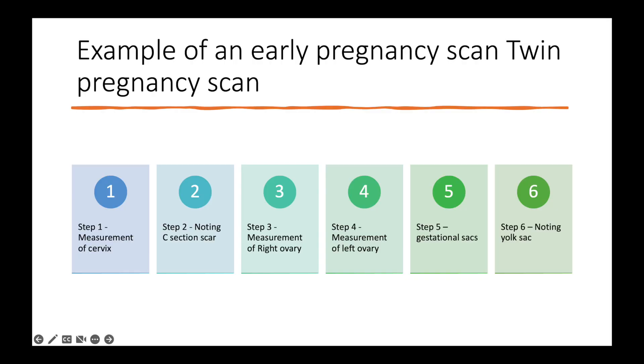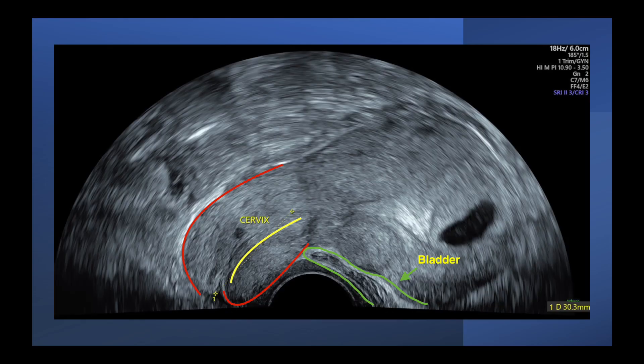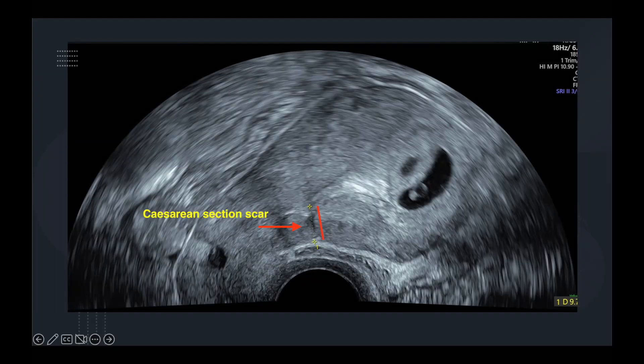This is an example of an early pregnancy scan which shows steps one through six. Step one is measurement of the cervix. The red line highlights the entire cervix, with a yellow line in the center being the endocervical canal. It starts from the reflection of the bladder to the lip of the cervix.